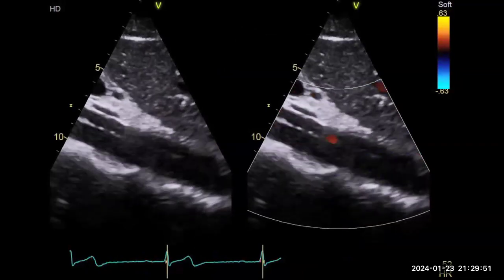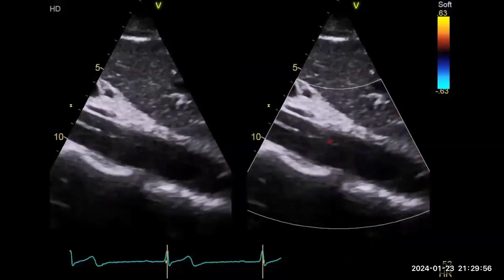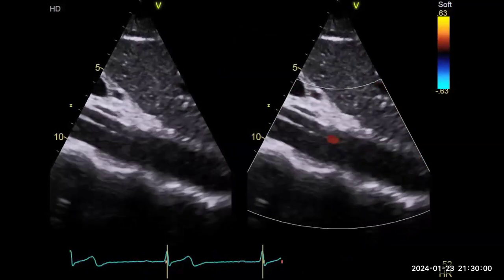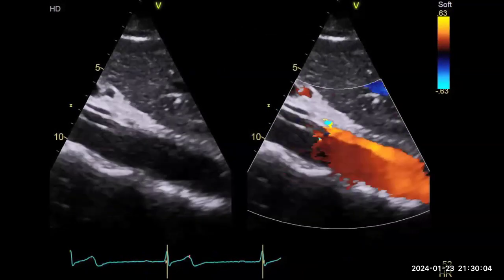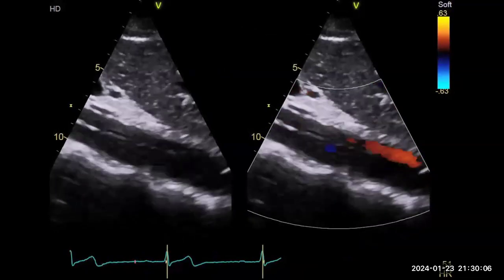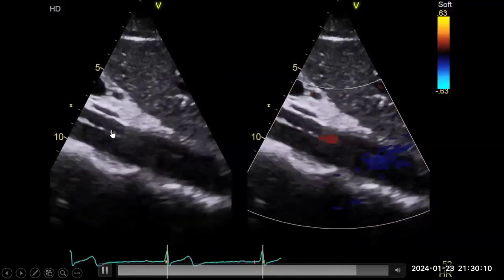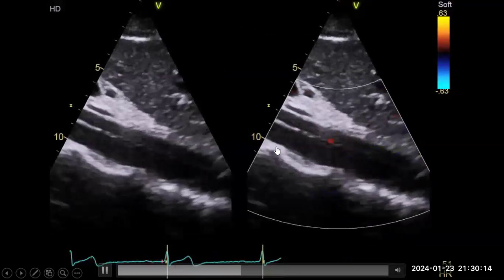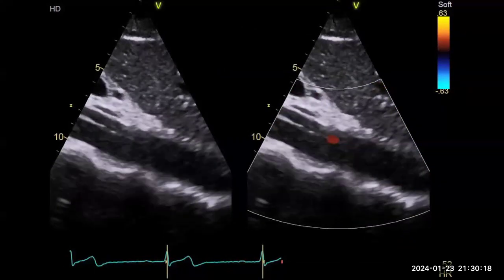Yes. So tell me, what do you see here? This is the abdominal aorta, and it is clear that there is a dissection flap. Okay, excellent. So before going to the CT or the TEE, just by putting the probe in the abdomen and scanning the abdominal aorta, you can see, as Dr. Abdulrahim mentioned, there is a clear dissection flap, with the true and false lumen beside each other. So conclude the case for me, please.